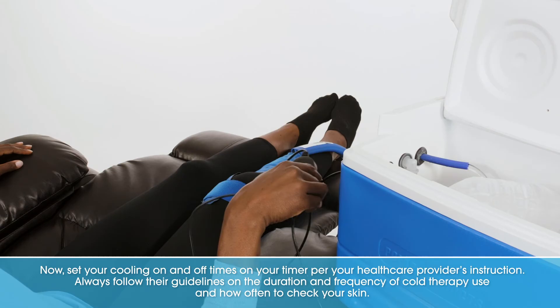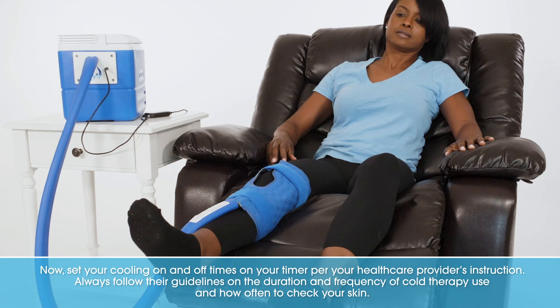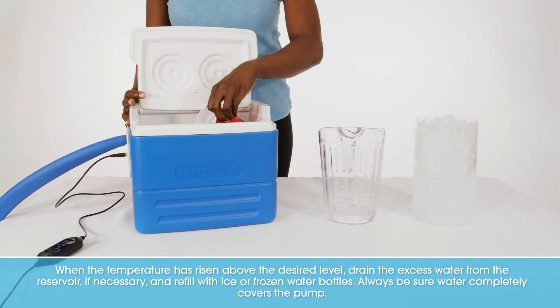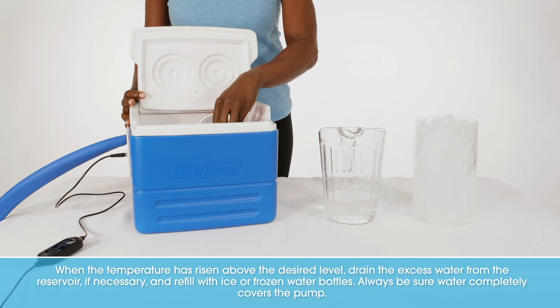Now, set your cooling on and off times on your timer per your healthcare provider's instructions. Always follow their guidelines on the duration and frequency of cold therapy use and how often to check your skin. When the temperature has risen above the desired level, drain the excess water from the reservoir if necessary and refill with ice or frozen water bottles. Always be sure water completely covers the pump.